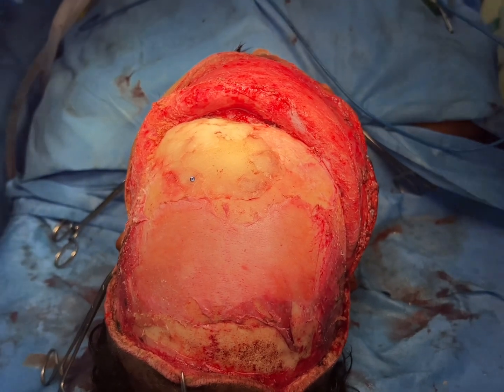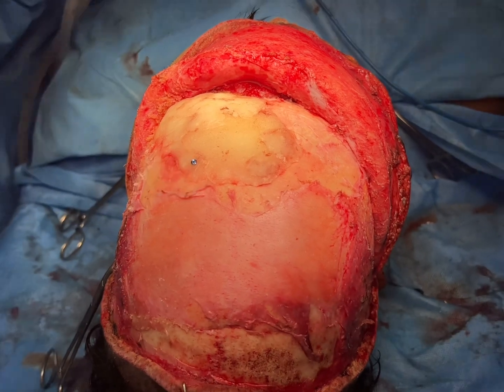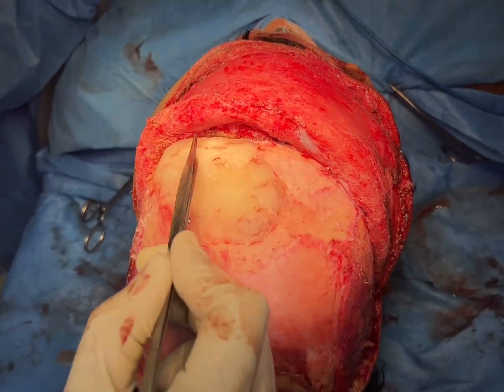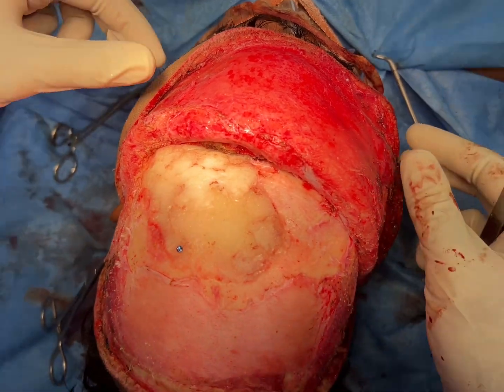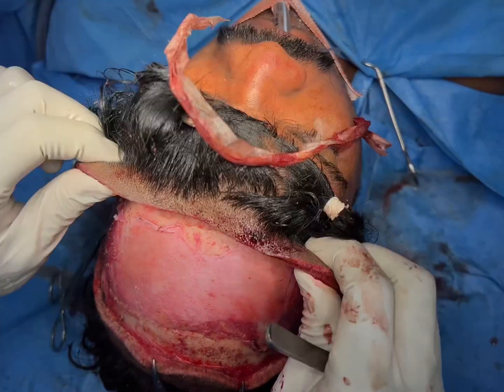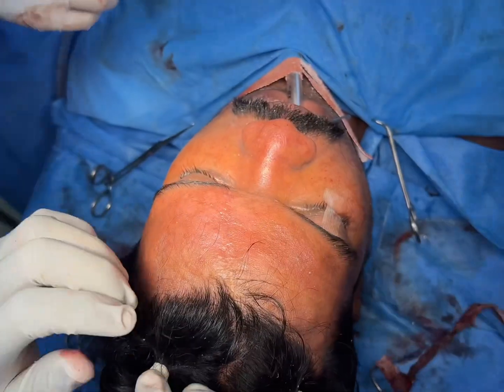We've fixed the patient-specific implant here with the screw, and we've got a beautiful contour — you can see this is a normal contour of the forehead. We're finishing with the surgery; I'm going to show you how nicely the forehead has been contoured.